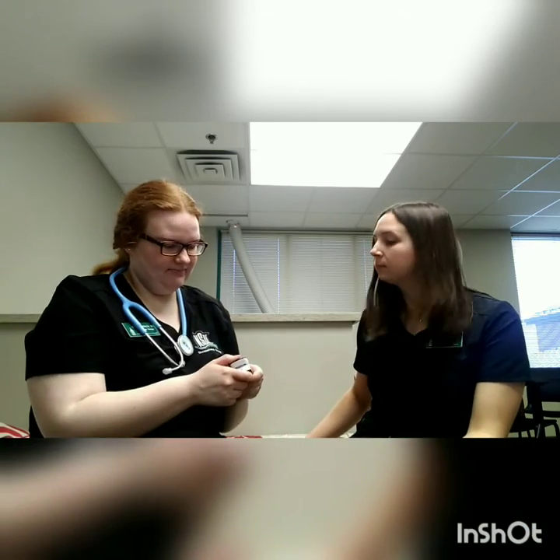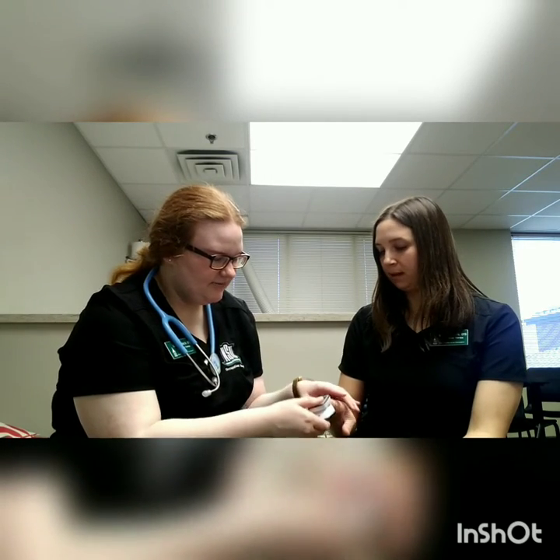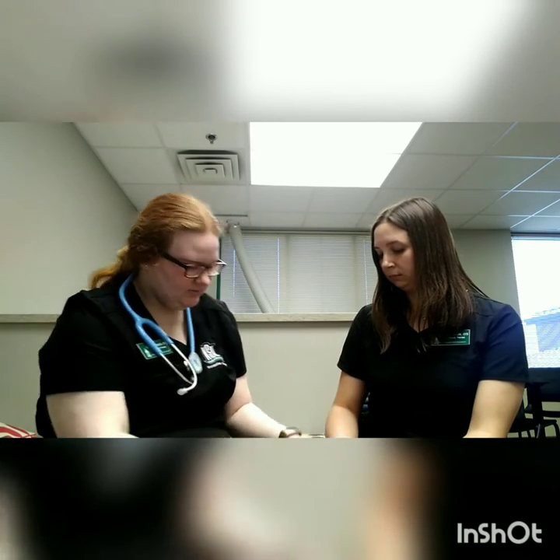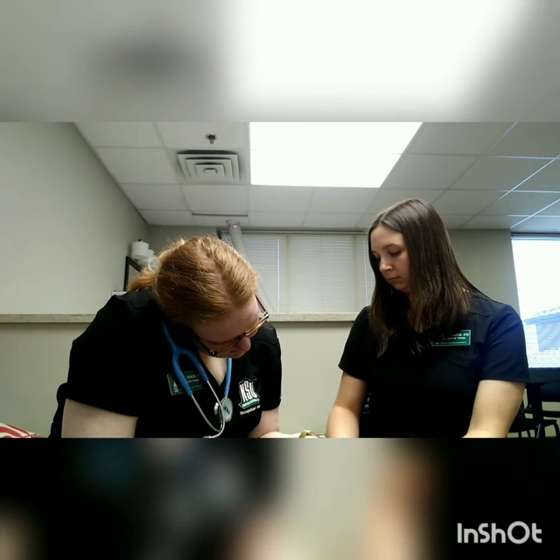So I'm going to start by taking your oxygen level. This is super easy — all you got to do is just put your finger in this little device here. So your oxygen is at 93, so it's a little bit low. We normally like to see it between 95 and 100, but it's nothing to contraindicate us beginning therapy today.